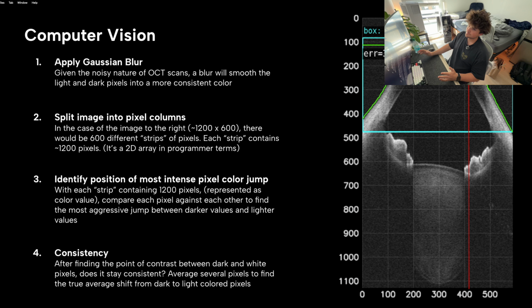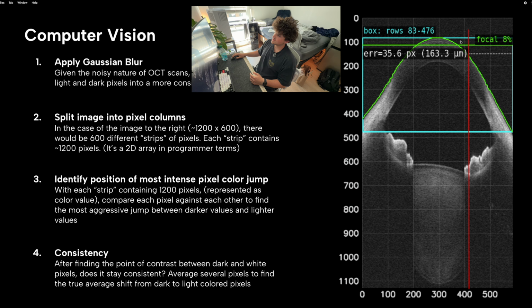So the computer vision works in a series of 4 major steps. The first one is to apply a blur, and you split the pixels into columns like a 2D array. And then you identify the position of the most intense pixel color jump. So as I go down this red line, for example, row by row, I wonder, when am I going from a darker region to this lighter region? We also look for consistency through a series of tests, but the main idea is, do the lighter colored pixels stay lighter as you go down?